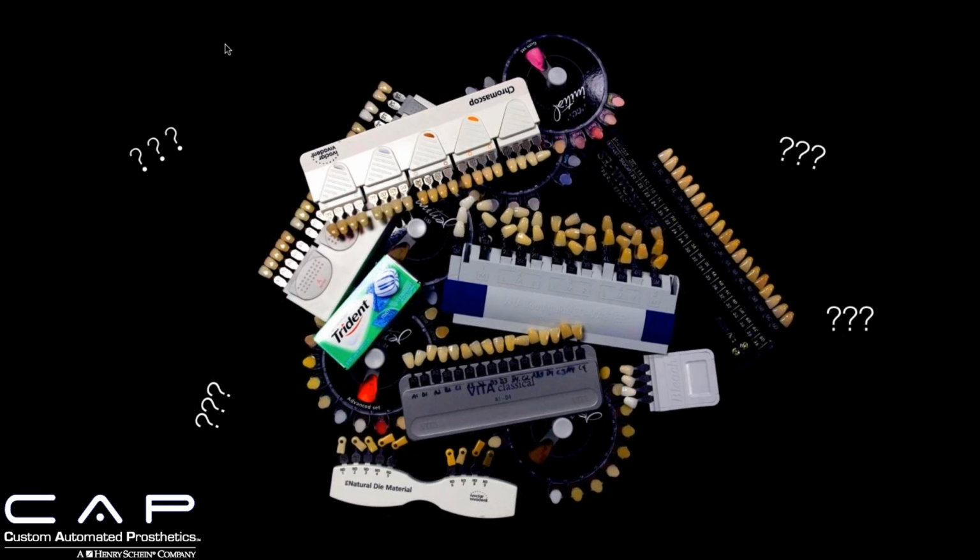You might be noticing the pack of gum sitting there. My good friend and doctor that I work with, Miles Cohn, he and I are doing a lot of custom shade tabs, and when we can't find anything that's even close, I say, I don't know, take a piece of bubble gum or chewing gum. If that matches, send it to me, and I'll match it to that. So it really doesn't matter. It could be a shoelace or whatever, so long as it matches or gives you an idea of where to go from there.